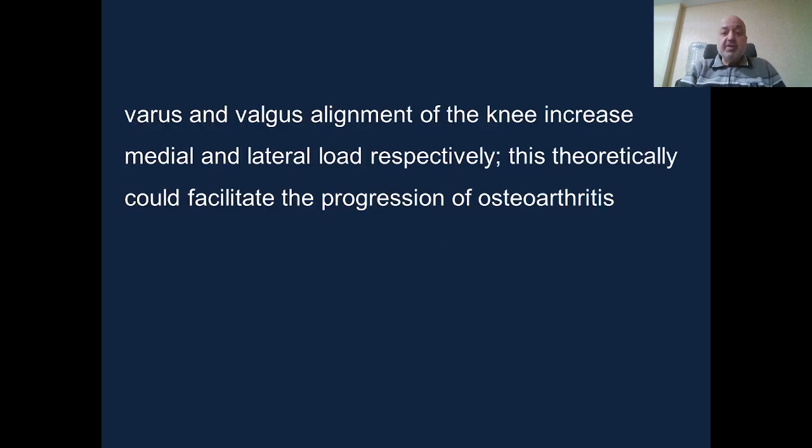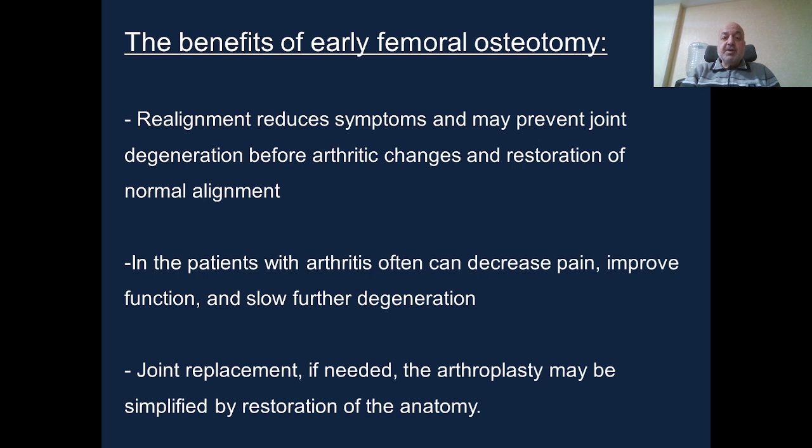Varus and valgus deformities of the knee increase medial and lateral load respectively. This theoretically could facilitate the progression of osteoarthritis. So the benefits of early femoral osteotomy realignment: it reduces the symptoms and may prevent joint degeneration before arthritic changes, and restores the normal alignment.